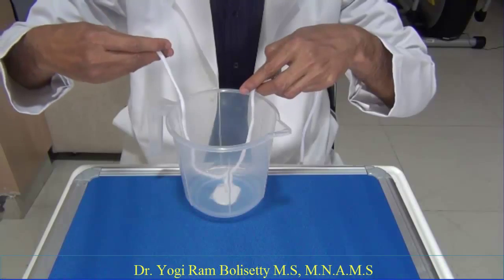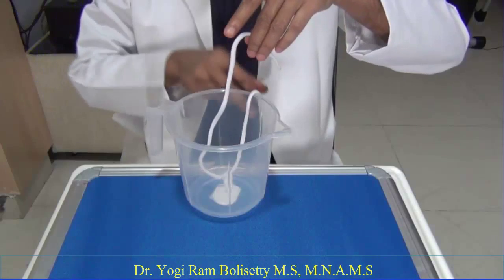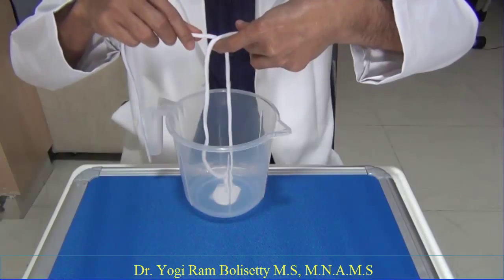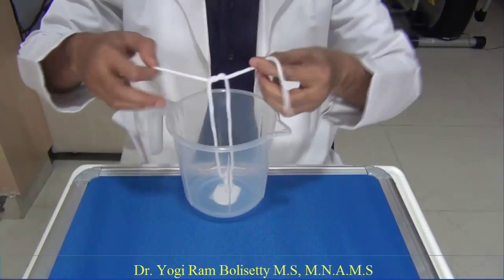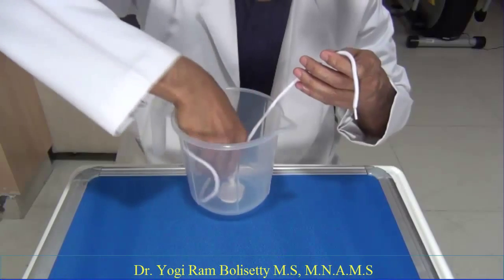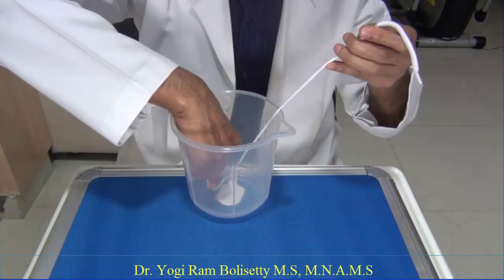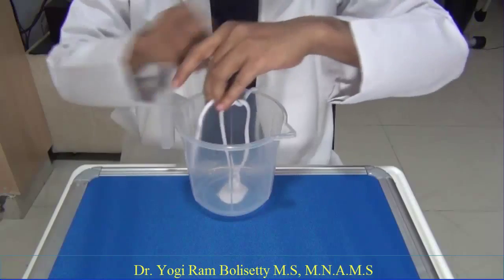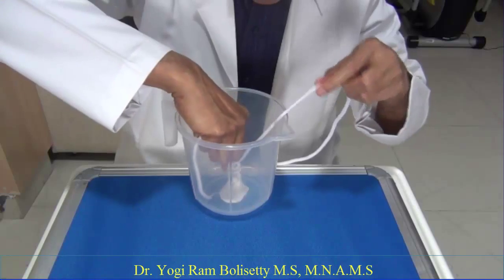If you want to make the third throw, again change the short strand to your left hand and the long strand into your right hand. Form the throw just like the first throw with the index finger — this is again the index finger throw. Then pull it down, pulling the strands exactly in the opposite direction at 180 degrees. This is how you form the knot in a deep cavity.